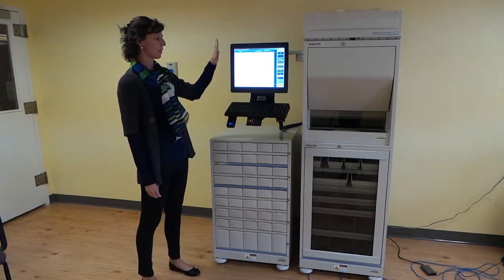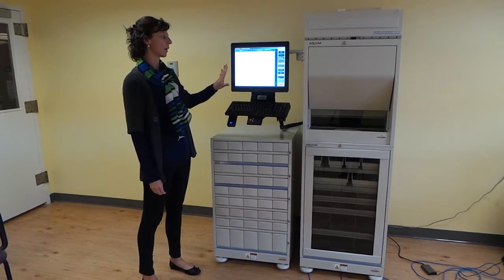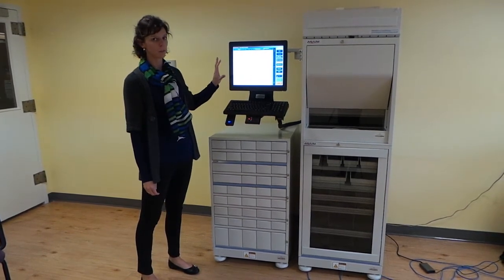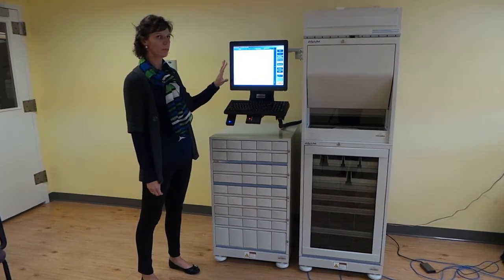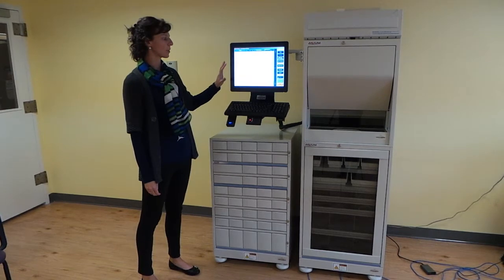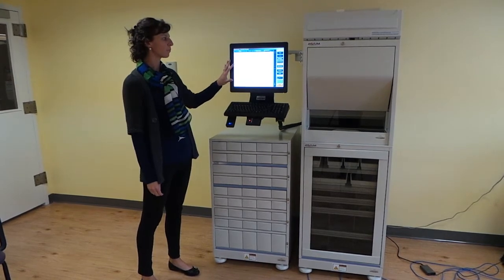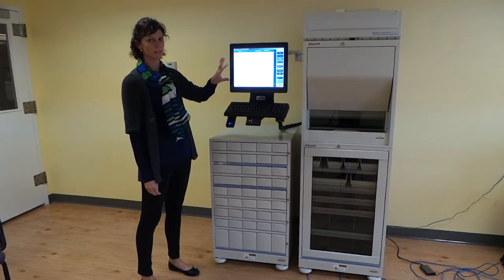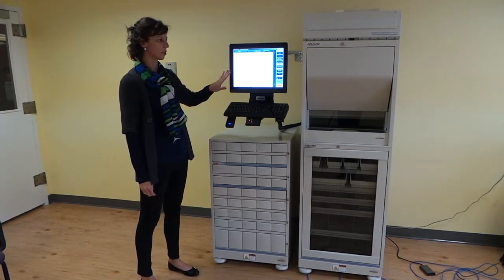To begin, the monitor here is all touchscreen and this is referred to as your display terminal. This is where you're going to log in, see your patient information, and dispense your medication.